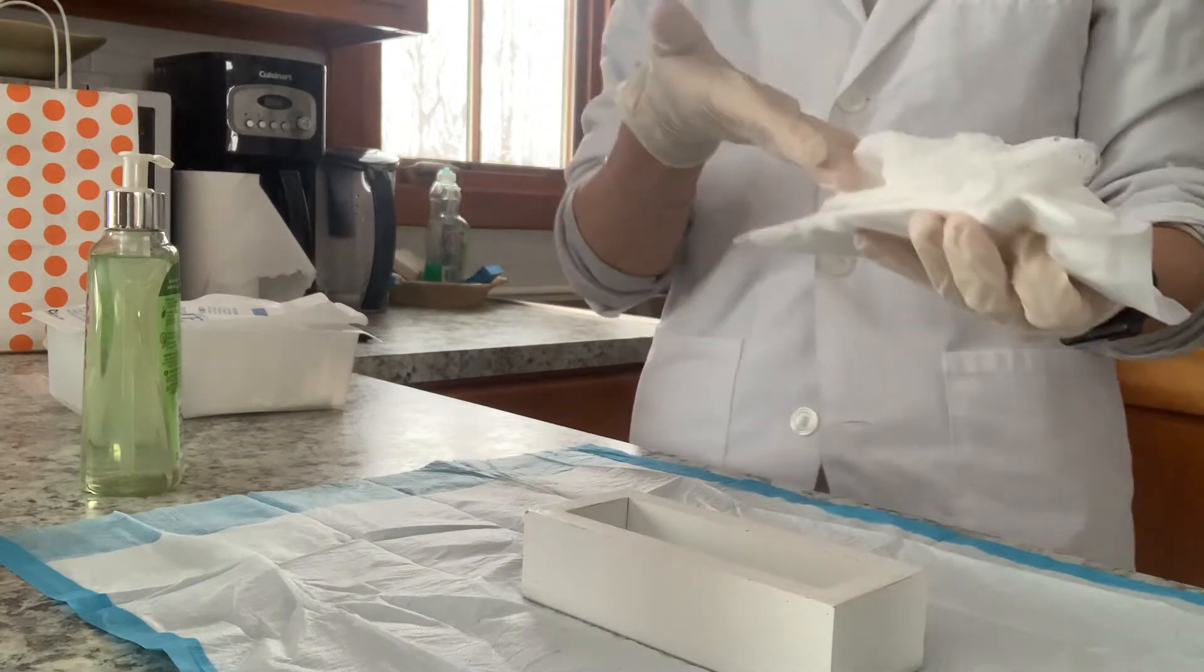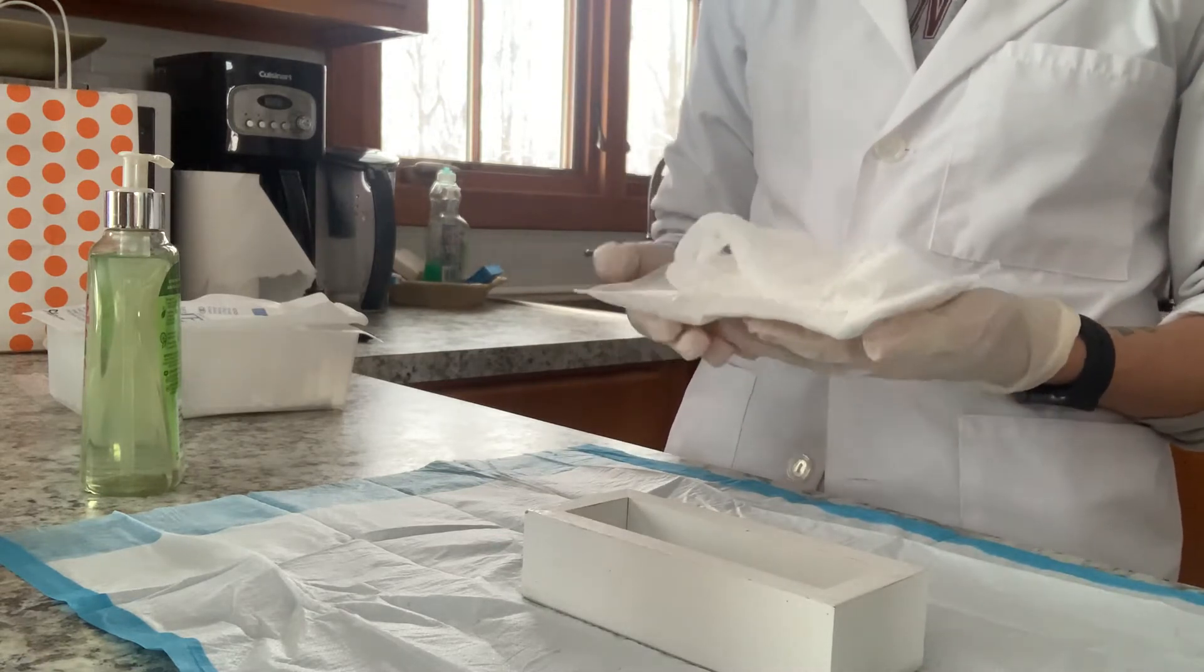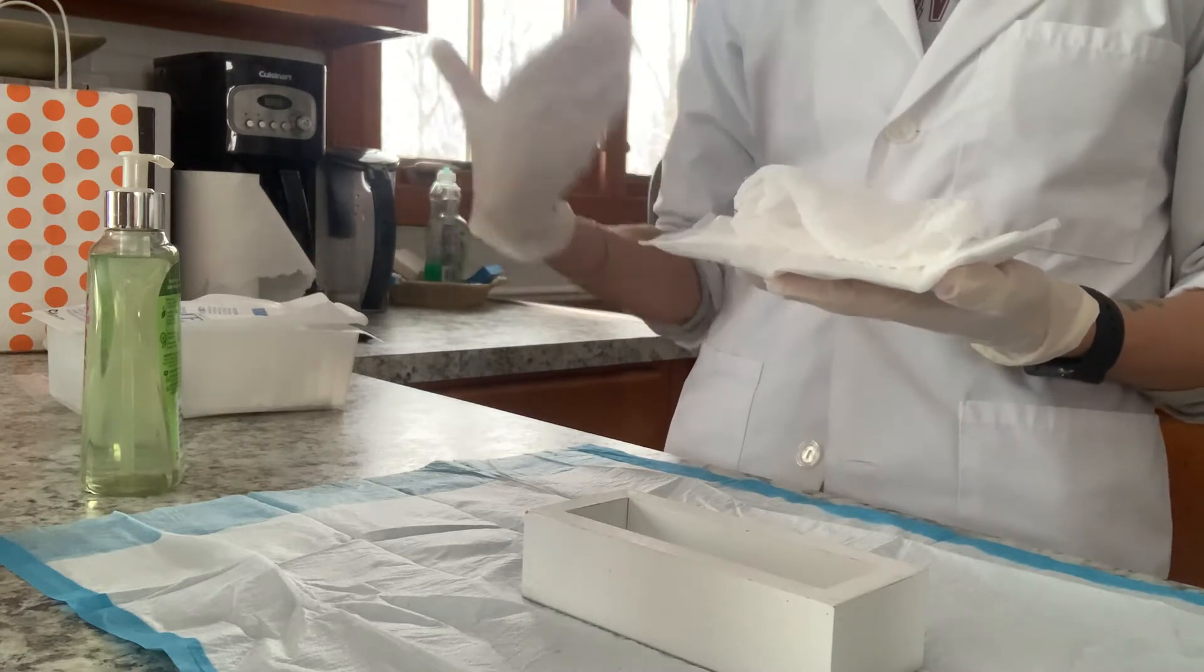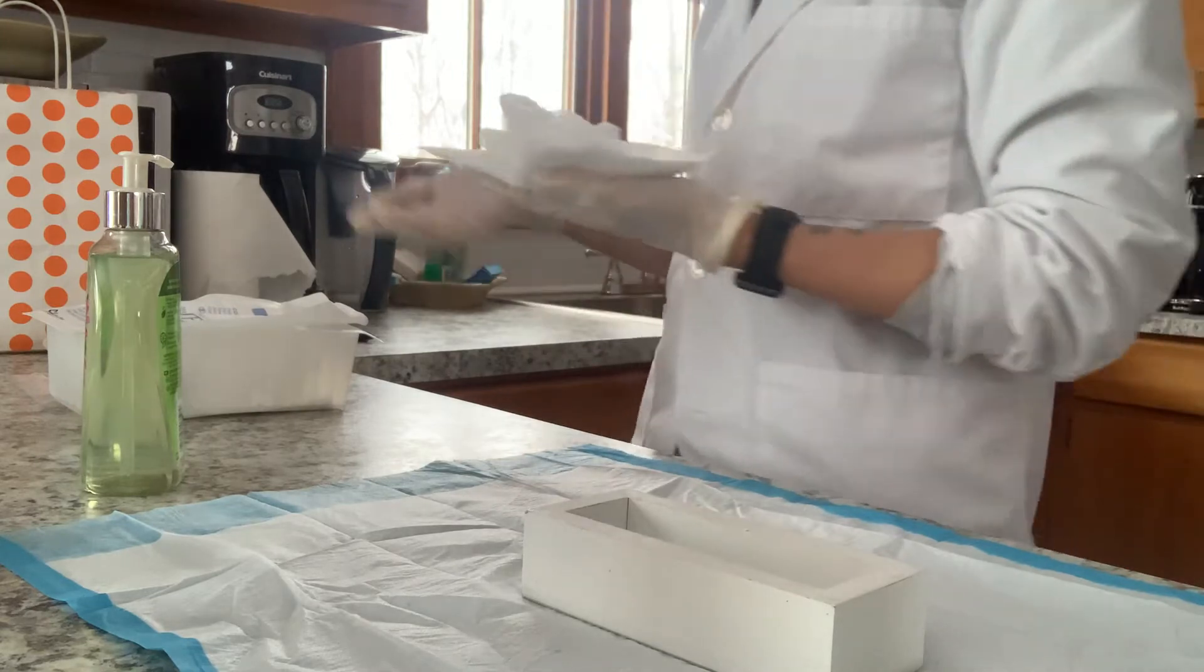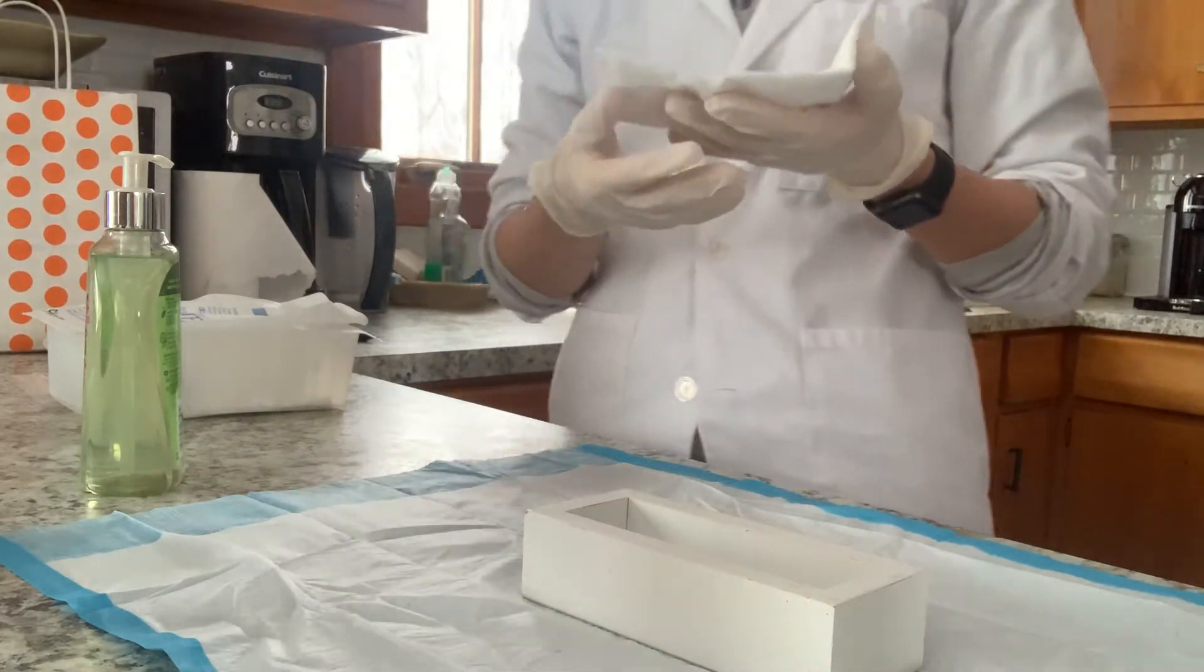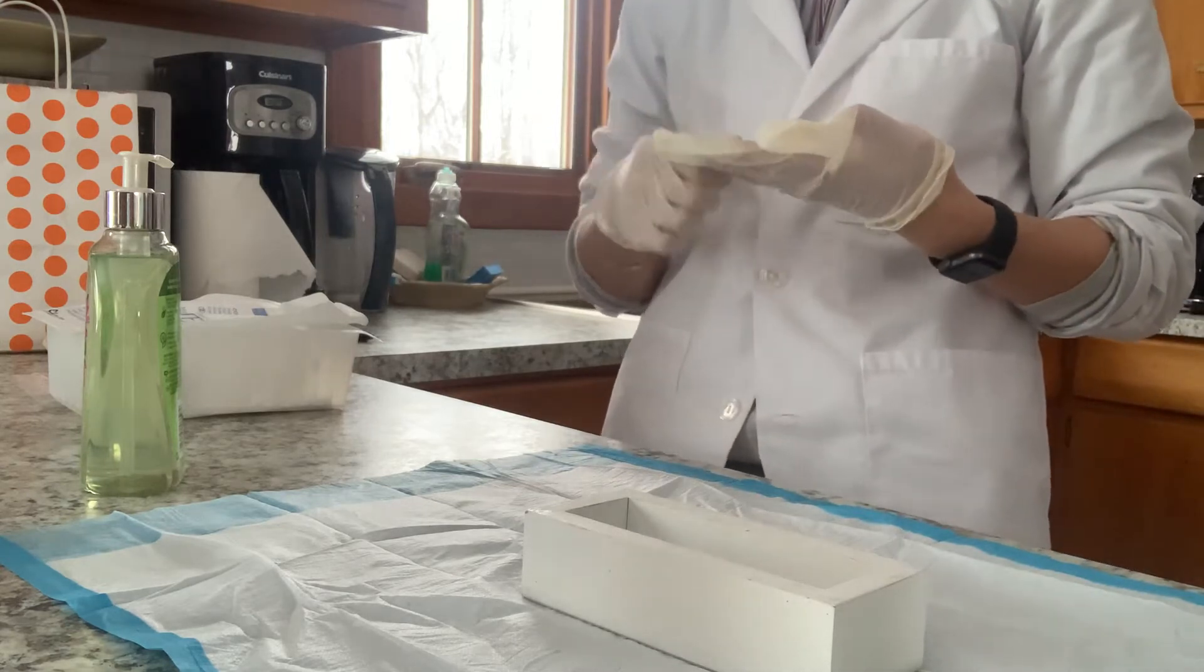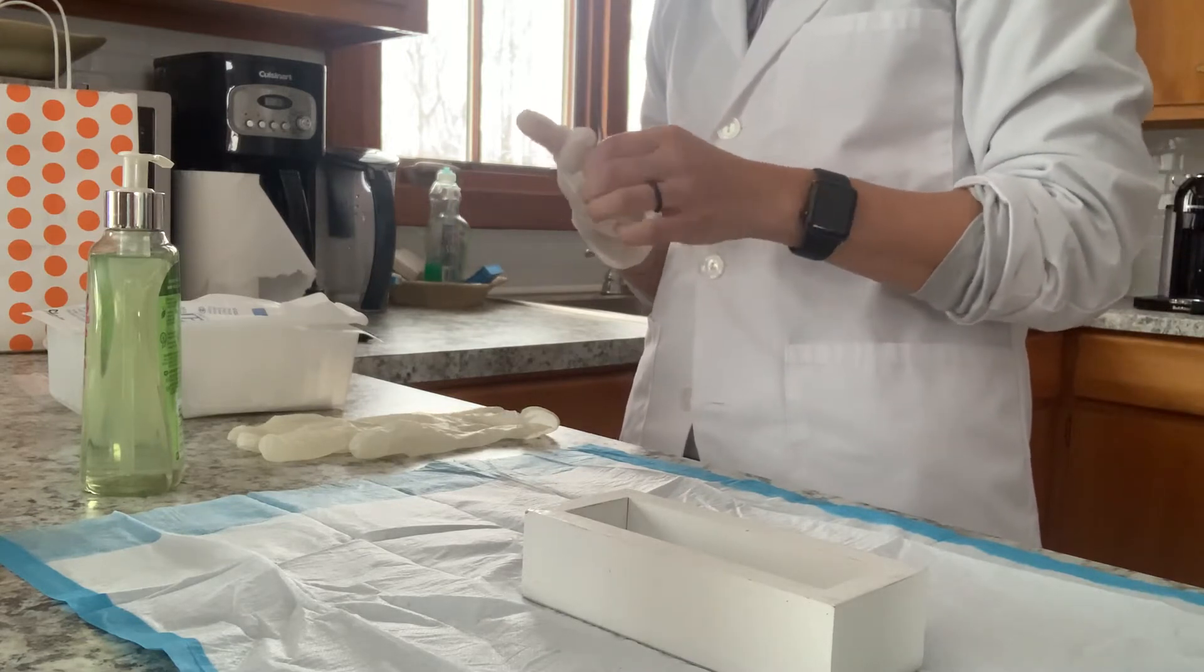So because I have touched the bandage, I'm obviously going to need to put on another pair of clean gloves. So what I would do at this point is I would check the bandage to see if there was any drainage. So I would then document the amount, the smell, the color, any characteristics that I feel are necessary to report back to the doctor. Then I would take this bandage and I would put it in a red bag. I'm just going to use this bag and I have to reuse this dressing. So I'm going to just put it in there for now.